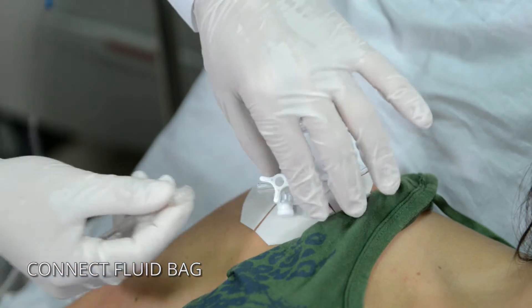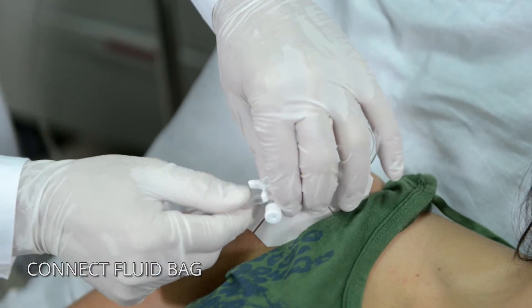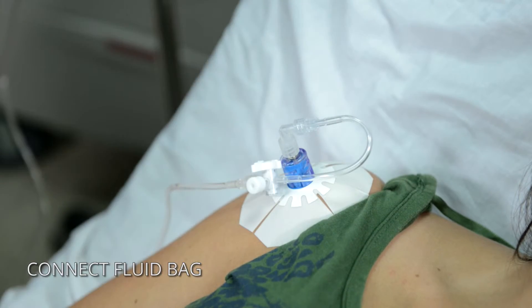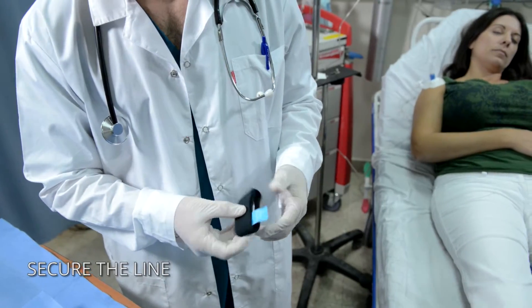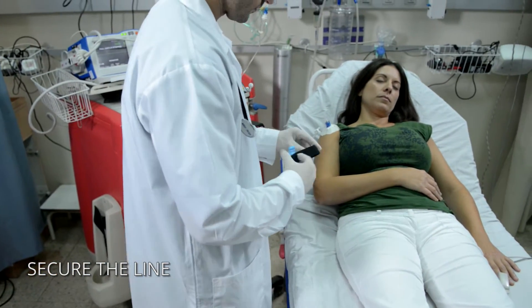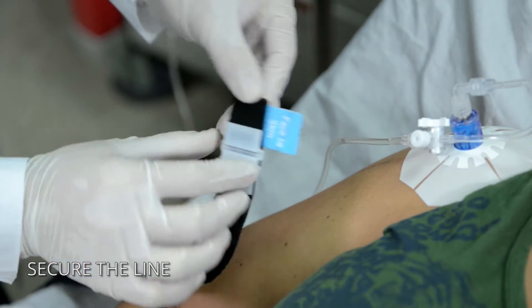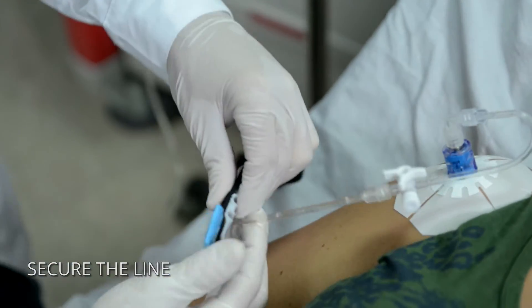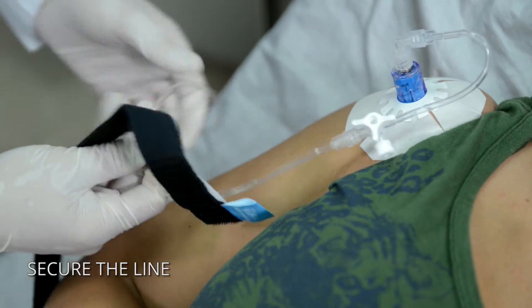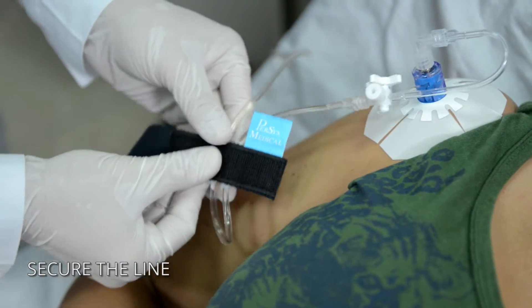Connect fluids and other items to the extension set as needed. Use the secure I.V. strap to provide protection against accidental line pulls. Snap the line into the quick-click connector channels and wrap the strap around the patient's arm near the access site.